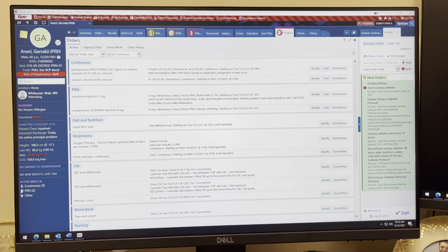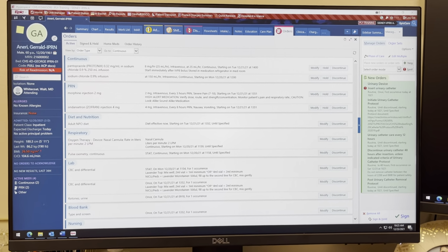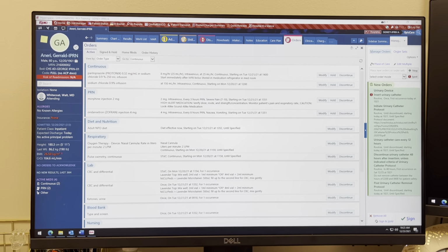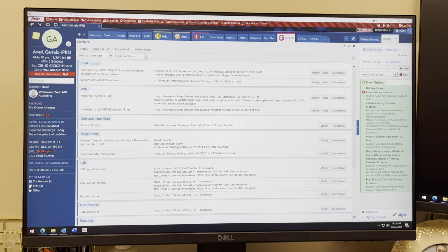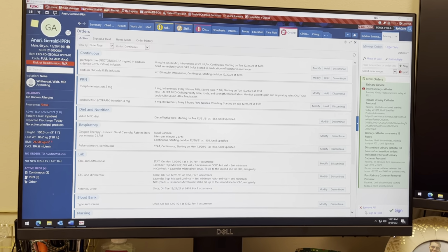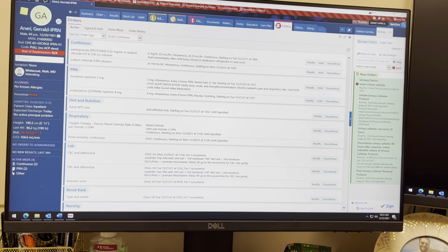Good afternoon, this is Aubrey and Jordan with Education, and today we're going to talk to you a little bit about Foley removals, what the protocol looks like for the nurse-driven Foley protocol removal, how to interpret it, what to do if your patient is showing signs of retention, and what the good justifiable reasons are for maintaining your indwelling catheter. So we have a written protocol on our urinary catheter placement, both the care, maintenance, and the removal.